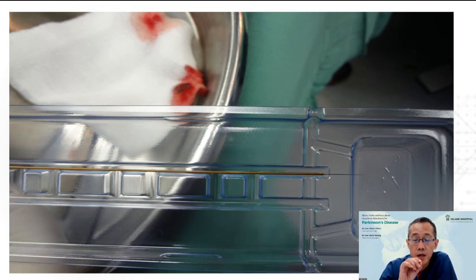That means the motor nucleus is in a different area. They produce different sounds, the activity sounds. So this gives us valuable information on whether we have reached the subthalamic nucleus or not, because the subthalamic nucleus has very distinct and very different motor activities. And based on this, it will enhance and improve our targeting process.